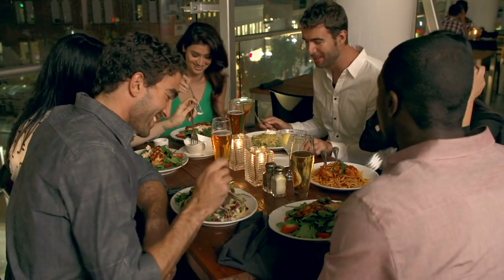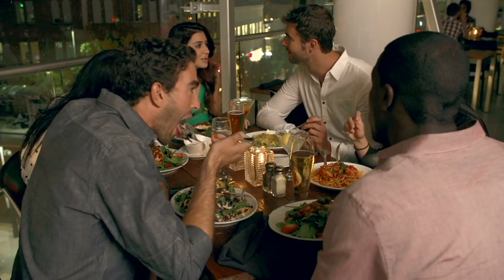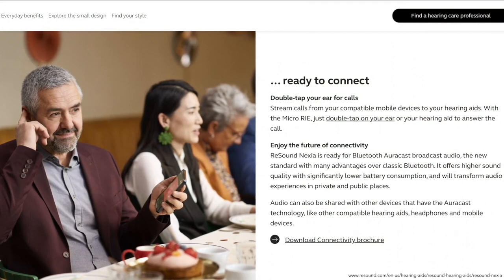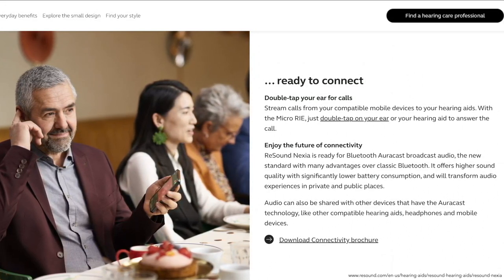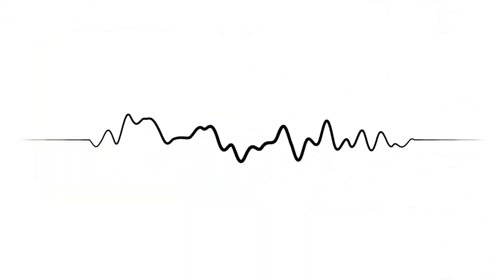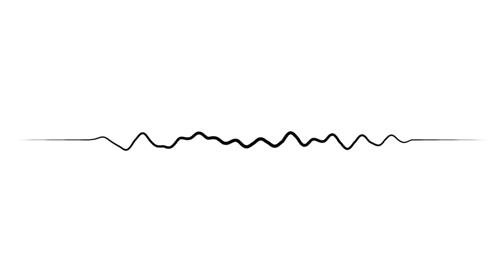One of the biggest concerns for everyone is hearing better in noisy situations. The ReSound Nexia employs cutting-edge technology for this: a pair of Nexia hearing aids uses four microphones and binaural beamforming technology to reduce background noise, combined with omnidirectional surround sound listening. You'll also enjoy a natural sound quality for your own voice, and speech will be more sharp and clear so you can hear and understand conversations with family and friends.